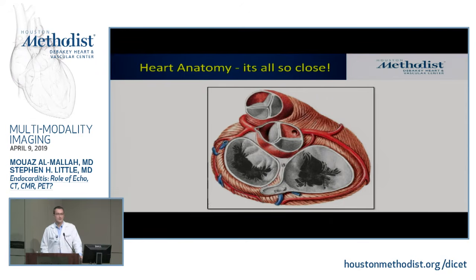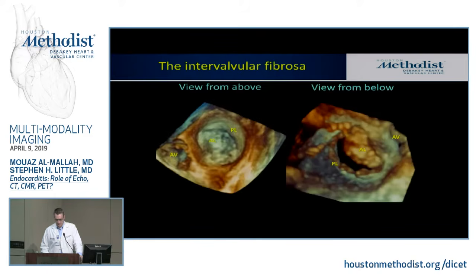So when you're doing the diagnostic imaging and there's a concern, that's where the sweep is incredibly important, and to get off the standard views. If you sweep and you see color that usually doesn't make any sense, in this scenario, it may make sense. So that's where the focused views to sort that out are very helpful.